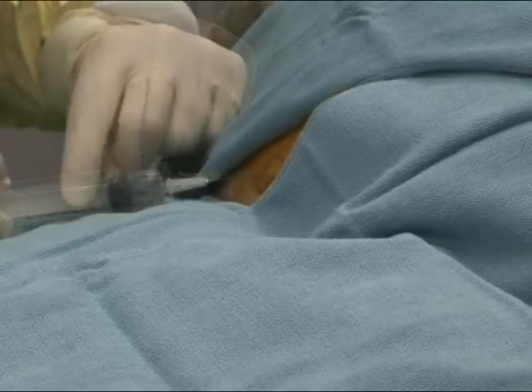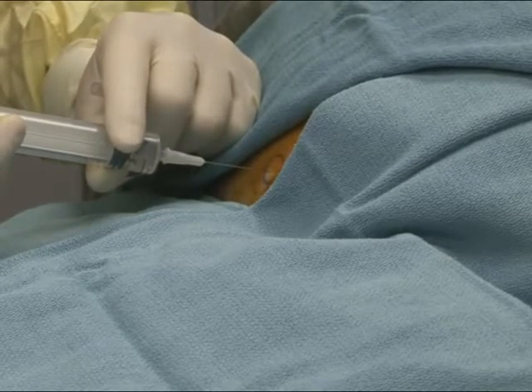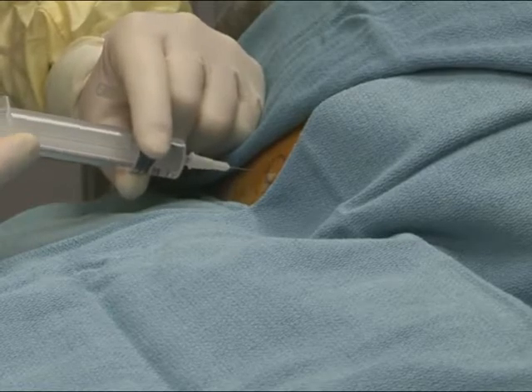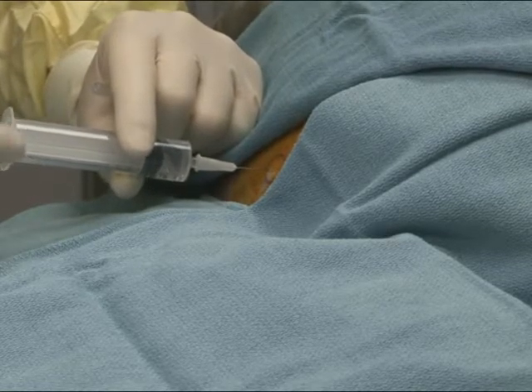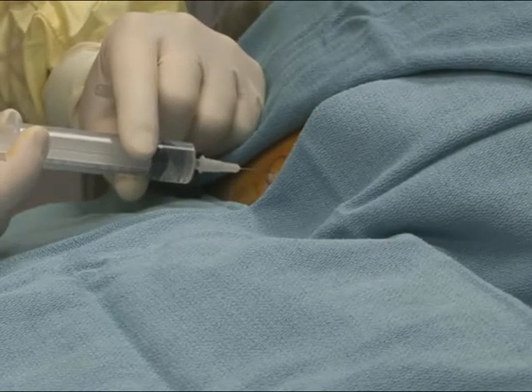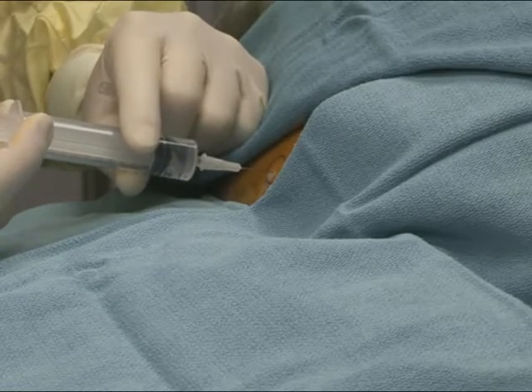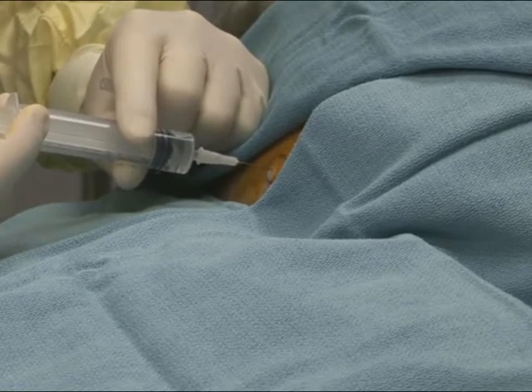Inject a wheal in the skin, then insert the needle perpendicular to the abdominal wall through the center of the wheal into the subcutaneous layer, where a ½ cc of solution is injected. Advance the needle 1/2 centimeter at a time into the muscle and inject another ½ cc. Continue to advance the needle at ½ centimeter increments. Maintain suction on the syringe as the needle is advanced until the abdominal cavity is entered.